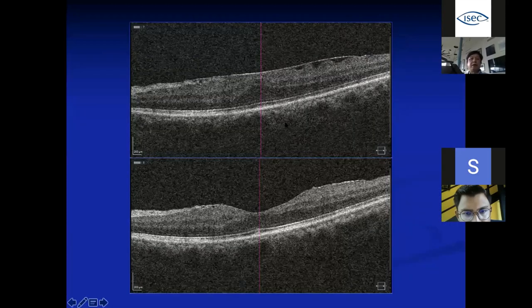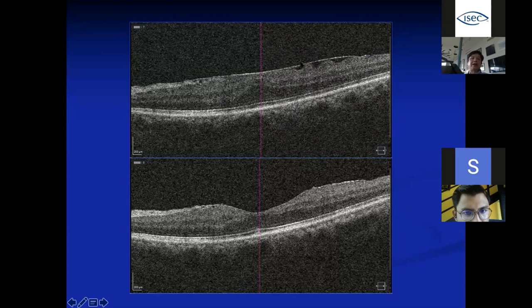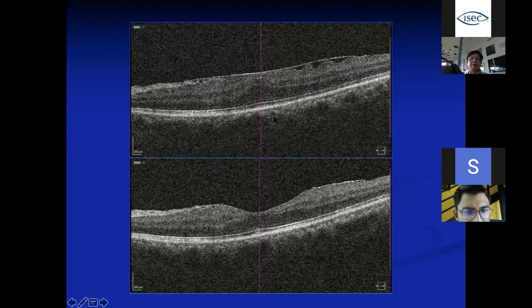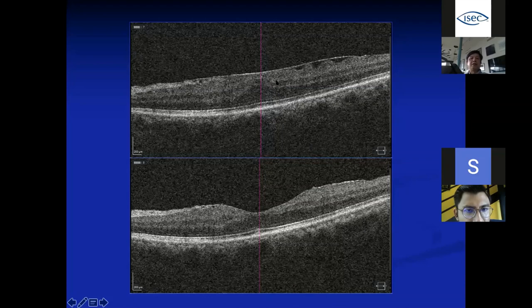Another pre- and post-op example: on OCT you can always see this hyper-reflective line on the retinal surface in ERM, and you can always see the macular edema with loss of the foveal contour. When the outer part of the retina is not compromised, good vision recovery is possible after surgery. Importantly, this is NOT AMD — there is no breach in the RPE. Many people get confused and want to inject anti-VEGF: no — this is a mechanical problem from the membrane, and surgery is needed to remove the membrane. The edema will then resolve.